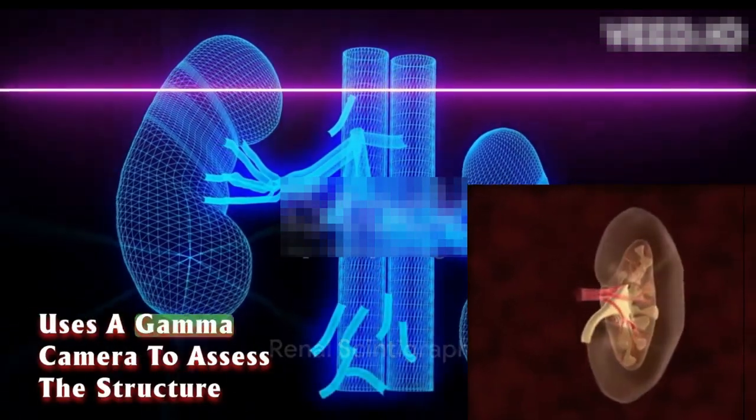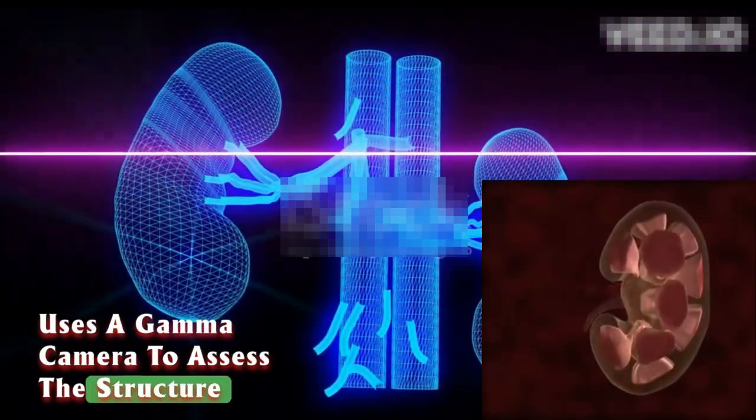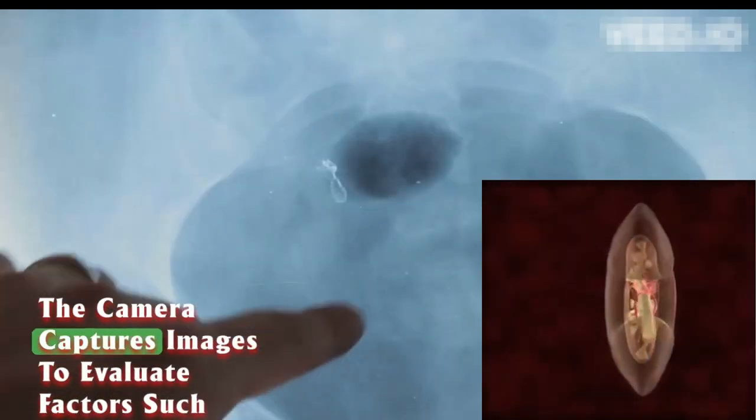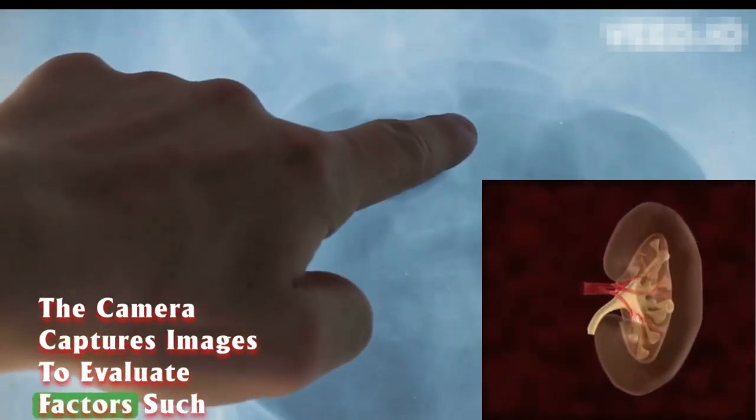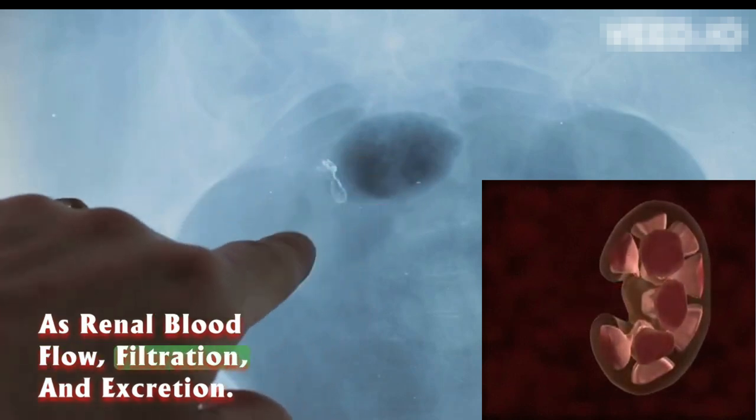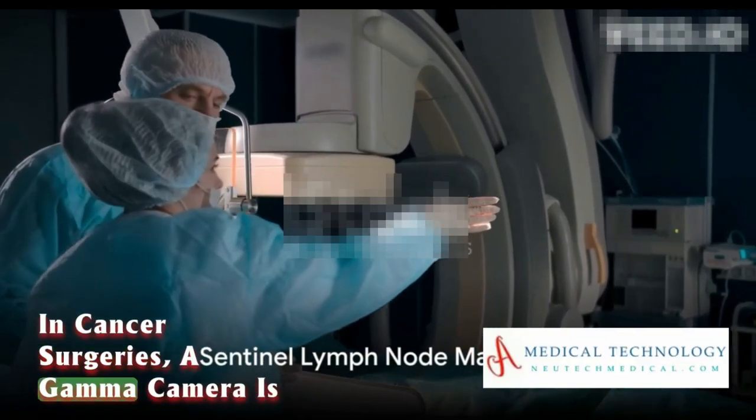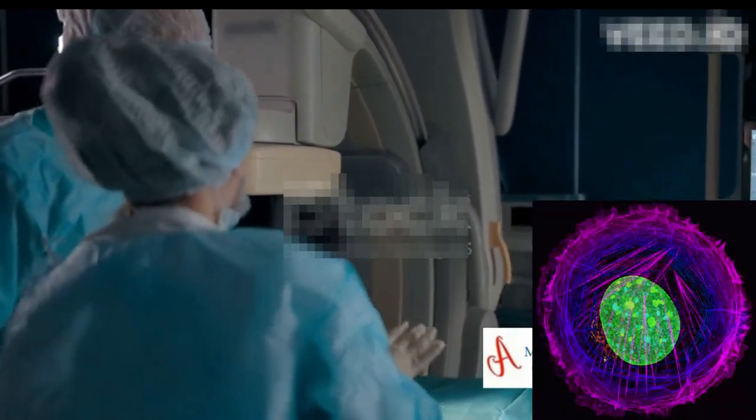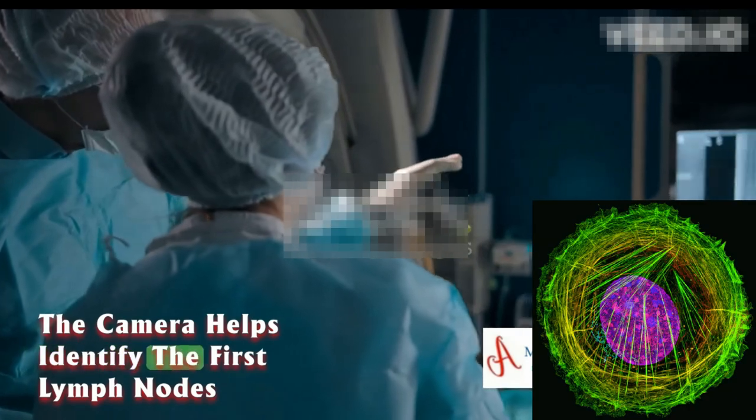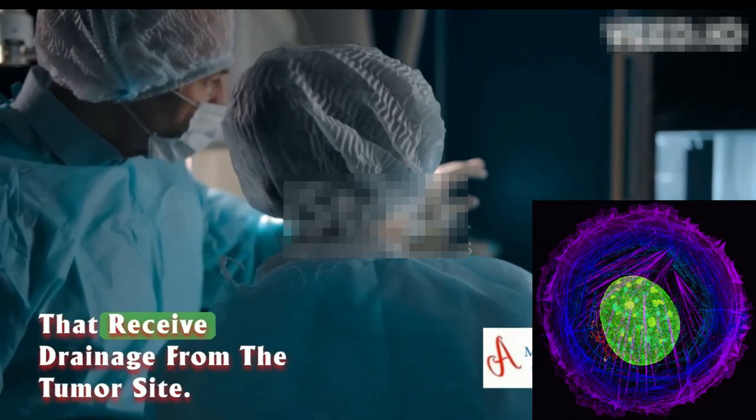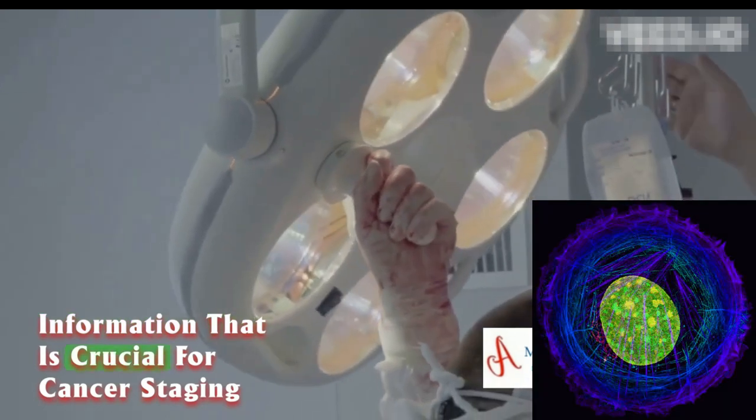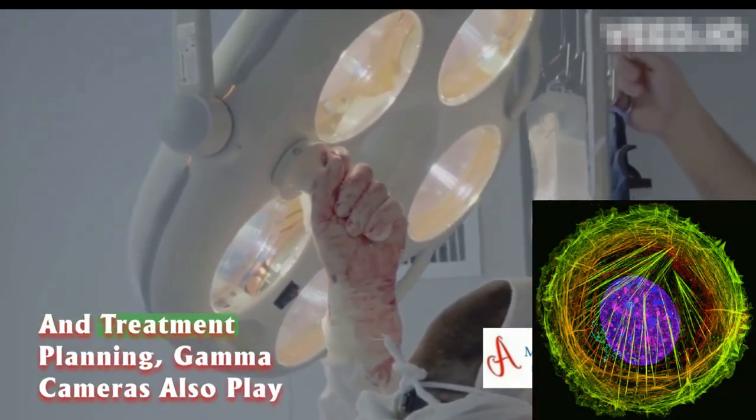For the kidneys, renal scintigraphy uses a gamma camera to assess the structure and function of these vital organs. The camera captures images to evaluate factors such as renal blood flow, filtration, and excretion. In cancer surgeries, gamma cameras are utilized for sentinel lymph node mapping, helping identify the first lymph nodes that receive drainage from the tumor site, crucial information for cancer staging and treatment planning.